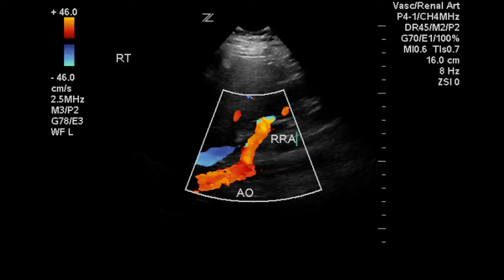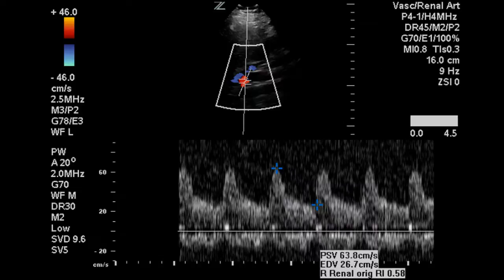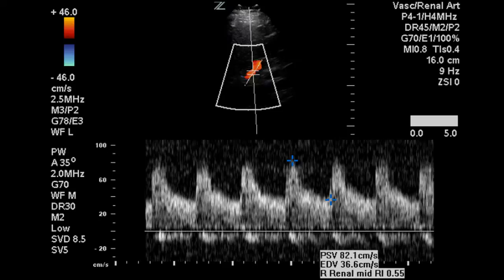This is a beautiful image of the origin and distal portions of the right renal artery coming off the aorta. This is the proximal portion of the right renal artery — the area where most disease will be found. We get a normal resistive index and a peak systolic velocity of approximately 64 centimeters per second. In the mid portion of this artery, we get a peak systolic velocity of 82 centimeters per second and a resistive index of 0.55. These are normal numbers.